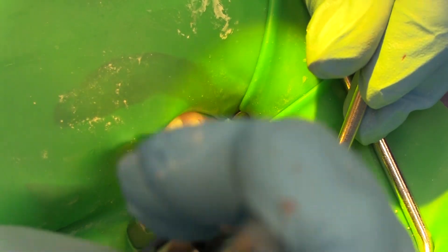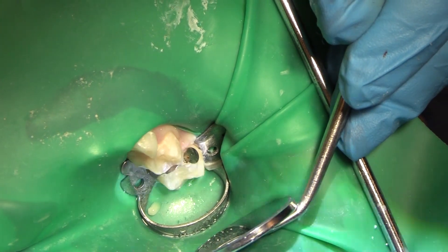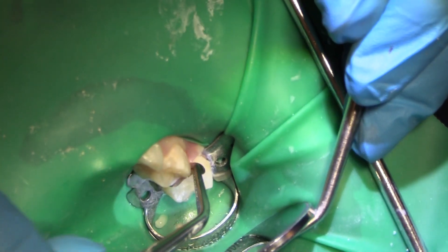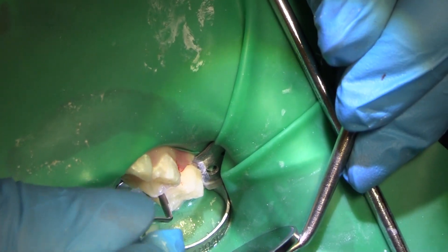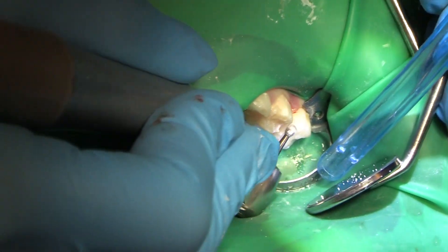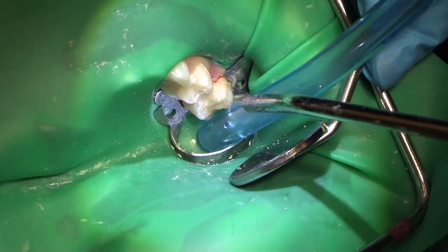Now I'm taking that matrix band off, getting a forcep ring in there, and taking our wedge out. Some people put the matrix band in first, then the ring, then the wedge last. I like to go band, wedge, ring — just a preference. That's a nice tight contact, but since I'm touching the adjacent molar, the contact is kind of irrelevant in this particular case. We'll do some back-to-back MO-DOS sometimes, but not in this case. Just smoothing off that little marginal ridge where I've got a bit of sharpness after placing the composite and getting the flash off.